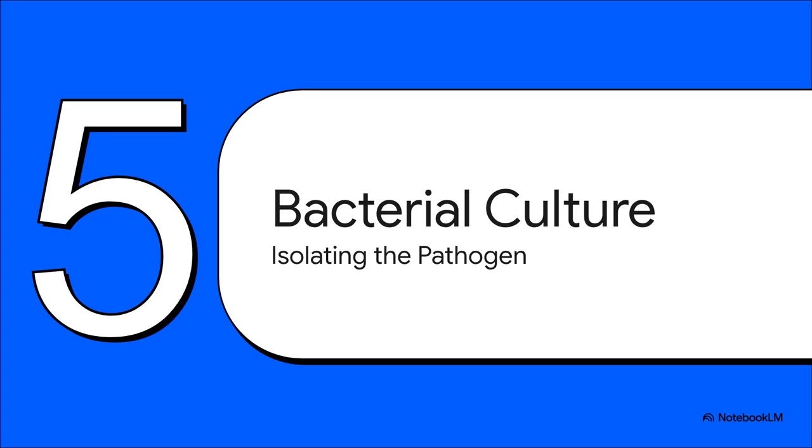This is the art and science of actually growing the bacteria in the lab. The whole point is to get a pure, isolated colony of the bad guy. Why? Because we need that live organism for a definitive ID, and most importantly for the patient, to see which antibiotics will actually kill it.